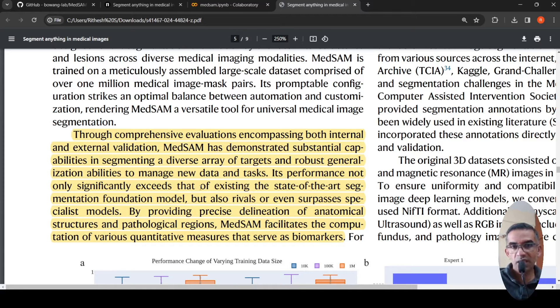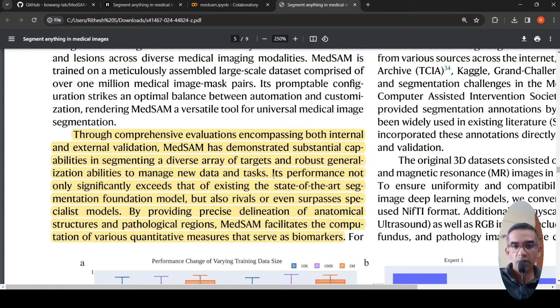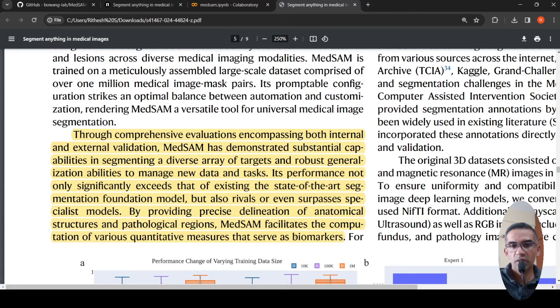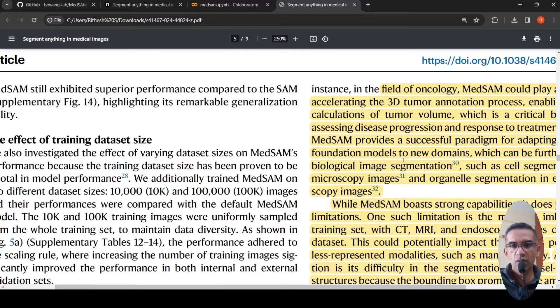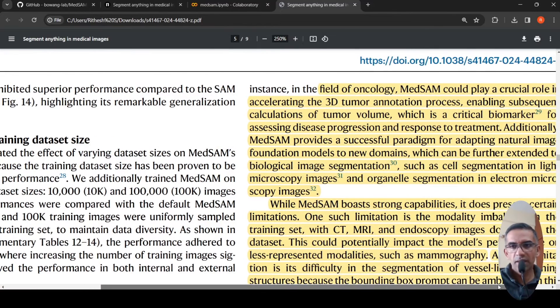The performance not only significantly exceeds state-of-the-art segmentation models but also rivals or even surpasses specialist models — for example, a specialist segmentation model for MRI or ultrasound. By providing precise delineation of anatomical structures, MedSAM facilitates computation of quantitative measures that serve as biomarkers, such as calculating tumor progression from 3D tumor annotations.